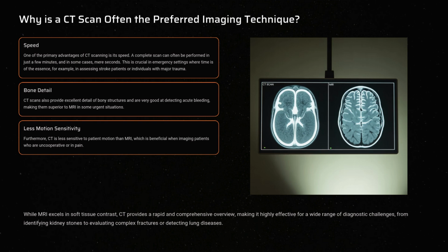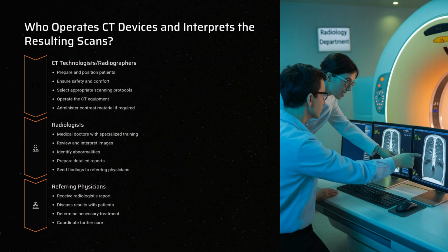Furthermore, CT is less sensitive to patient motion than MRI, which is beneficial when imaging patients who are uncooperative or in pain. While MRI excels in soft tissue contrast, CT provides a rapid and comprehensive overview, making it highly effective for a wide range of diagnostic challenges, from identifying kidney stones to evaluating complex fractures or detecting lung diseases. Who operates CT devices and interprets the resulting scans?